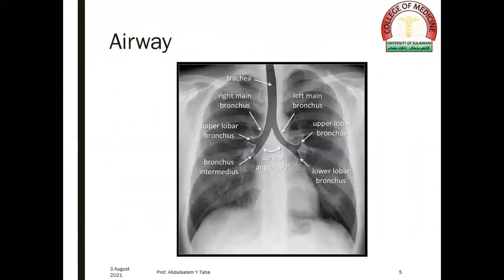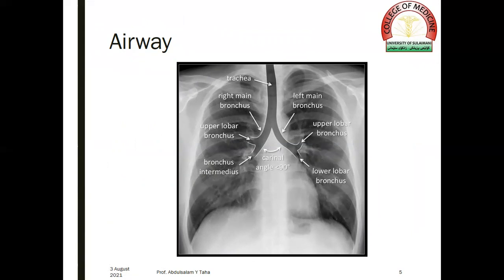We start by the airway. As you can see, the silhouette of the trachea, right and left mainstem bronchi, the upper lobe bronchus and bronchus intermedius on the right side, the upper lobe bronchus and lower lobe bronchus on the left side, and the subcarinal angle, which is less than 90 degrees normally.